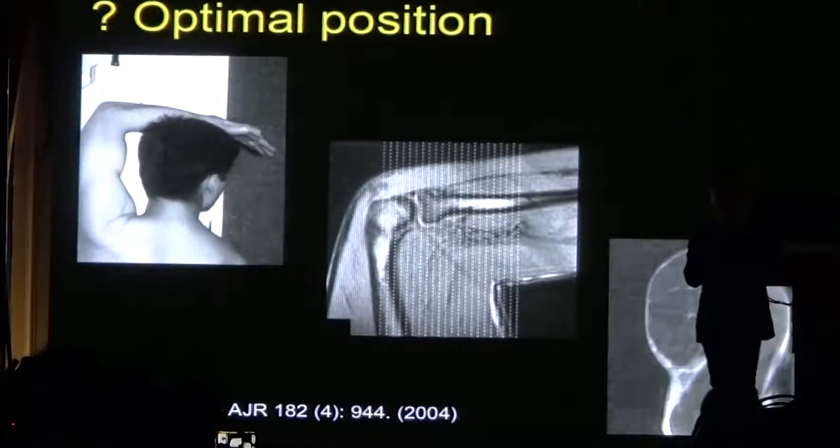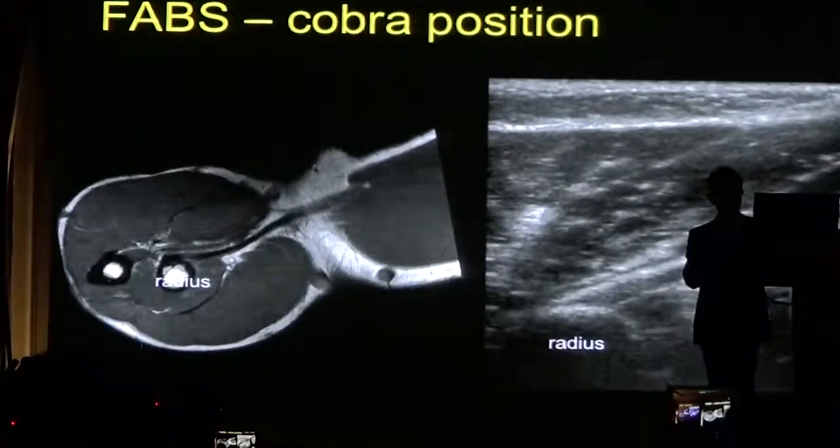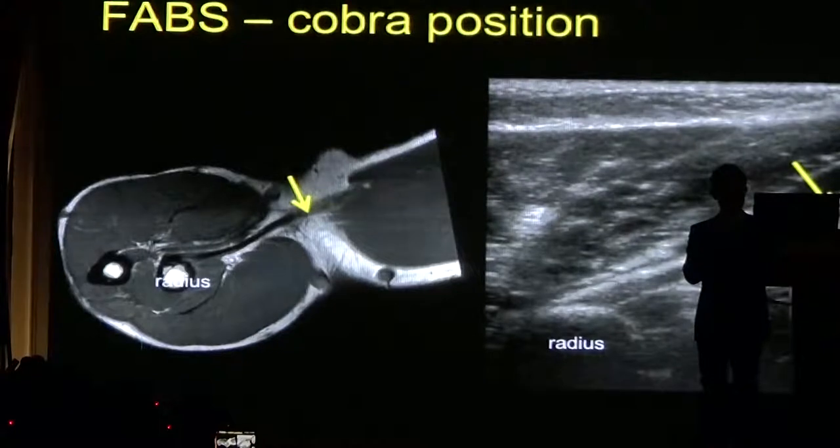Another good way of looking at the biceps tendon is with the elbow flexed — what we call the FABS position on MRI. We can see the long head of biceps attaching to the radial tuberosity. We can get a similar appearance if we scan the patient with the elbow flexed, giving a view very similar to the MRI. This is a good position for assessing the integrity of the tendon.